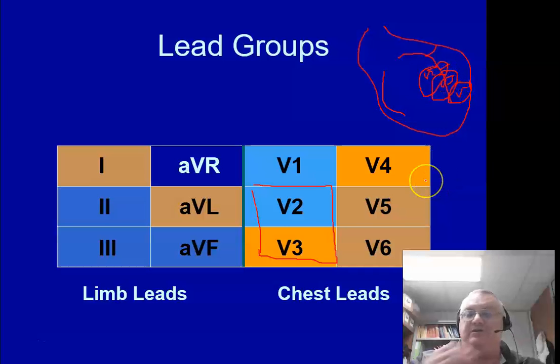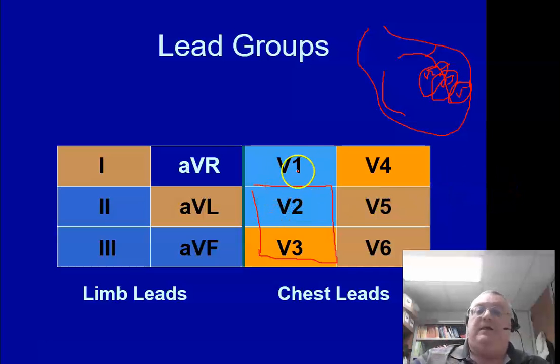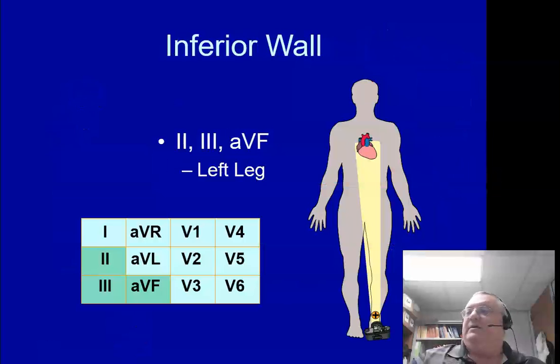There's different branches of those arteries that go off to those regions. So you could have a smaller block in those areas. Okay. I will tell you that normally you're probably going to get 2, 3, and 4 all together. Most always you're going to get 2, 3, and 4 together. Okay. So let's continue, shall we?